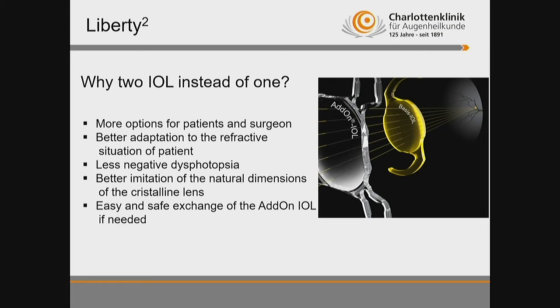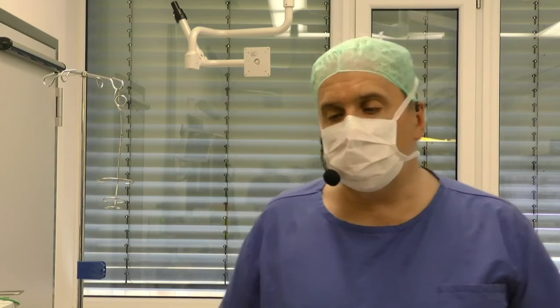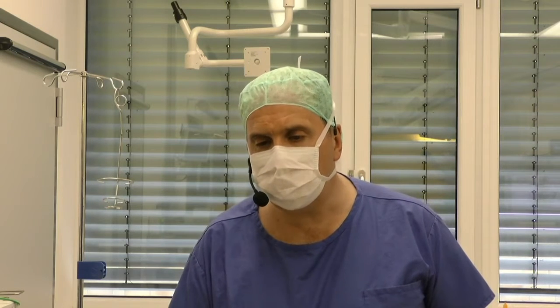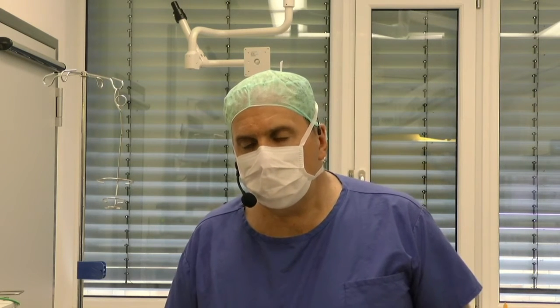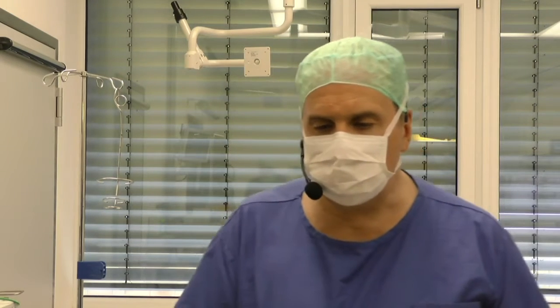It's obviously much better to do it in this way, because when the curvature and the meridians of the keratoconus eye differ and change, it's very easy to adapt the add-on lens to the new situation. And it's the same in the multifocal patient. You have more safety and a better refractive adaptation to the patients.